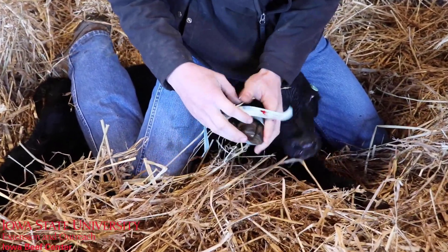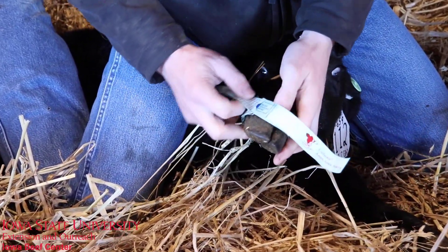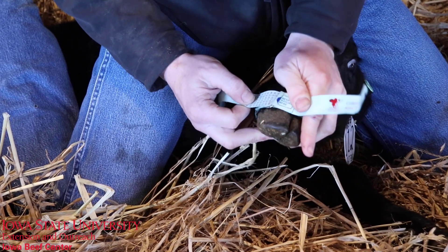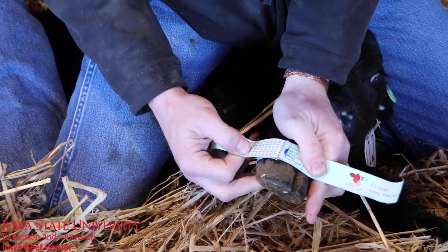We use a calf scale tape to determine the birth weight on all our calves out here at the Beef Teaching Farm. We use our calf scale tape to take a birth weight similarly to how we would with a spring scale measurement.